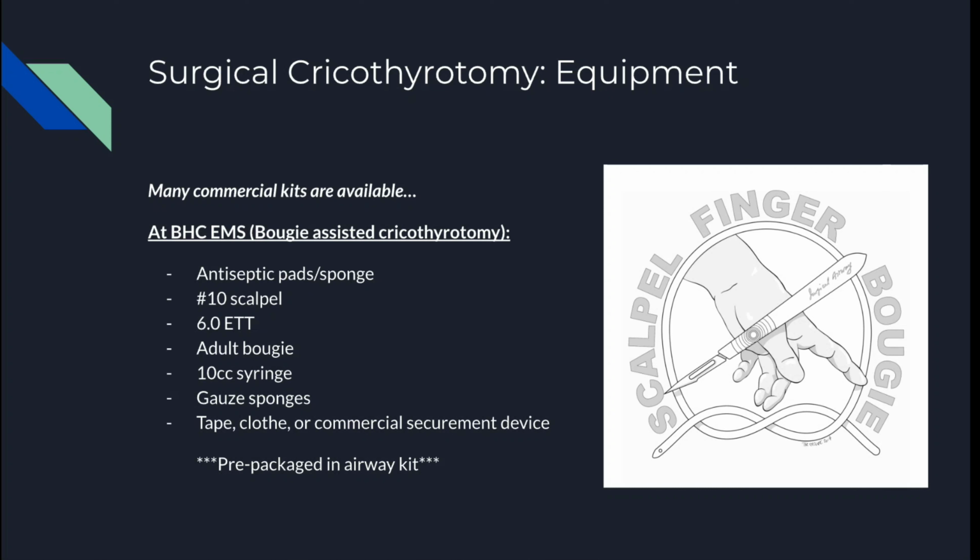What we are using with the ambulances comes from the scalpel finger bougie type of approach.